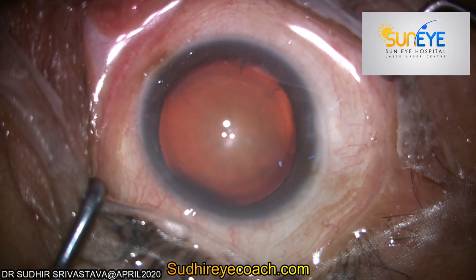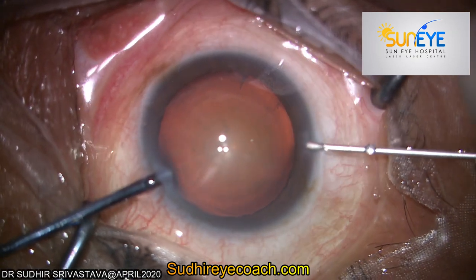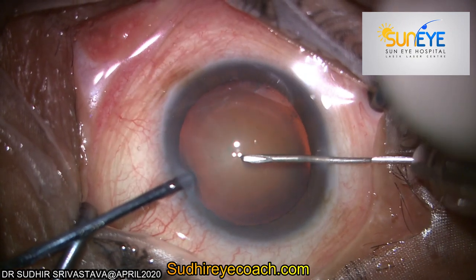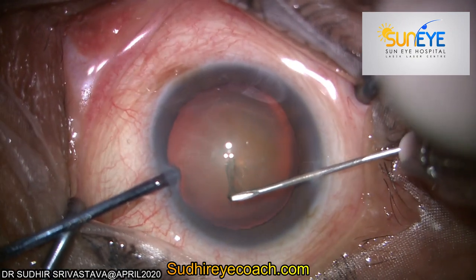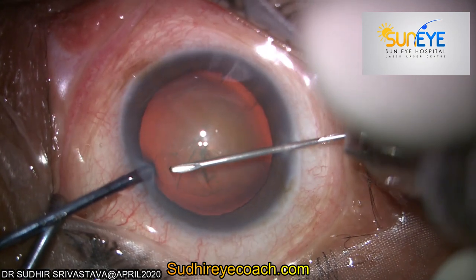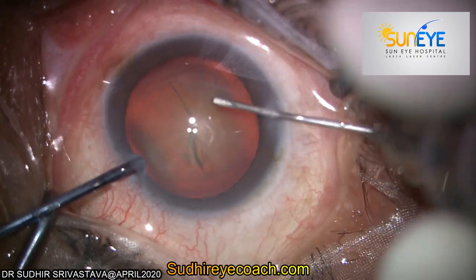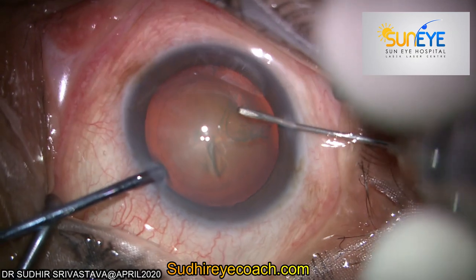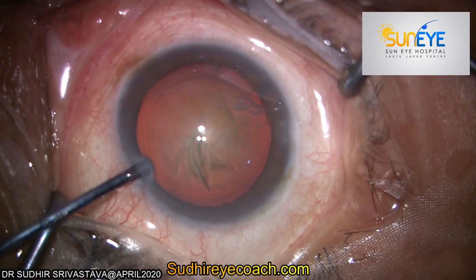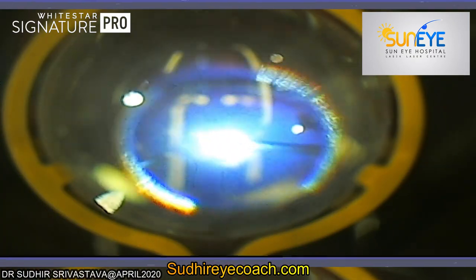For the controlled tearing or rexis of the anterior capsule, either we take the help of retro-illumination, or if retro-illumination is not available — like in mature cataract — we stain the capsule with trypan blue dye at 0.02–0.05% concentration. To start the capsule rexis, we lacerate the capsule at one point, hold it from one edge, and then tear it to the desirable size and shape.